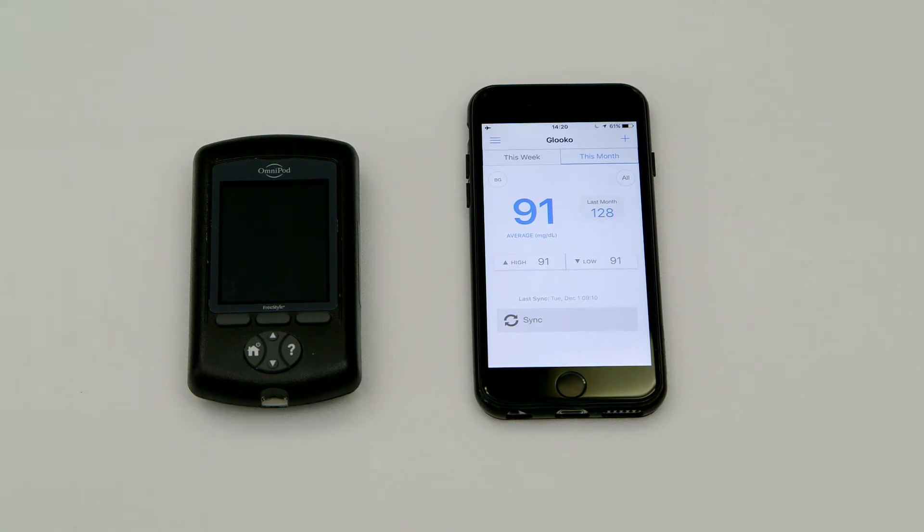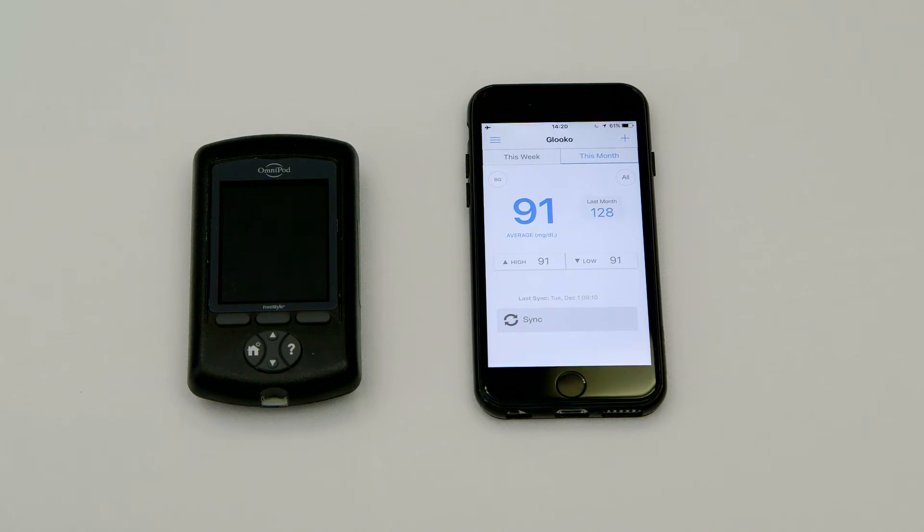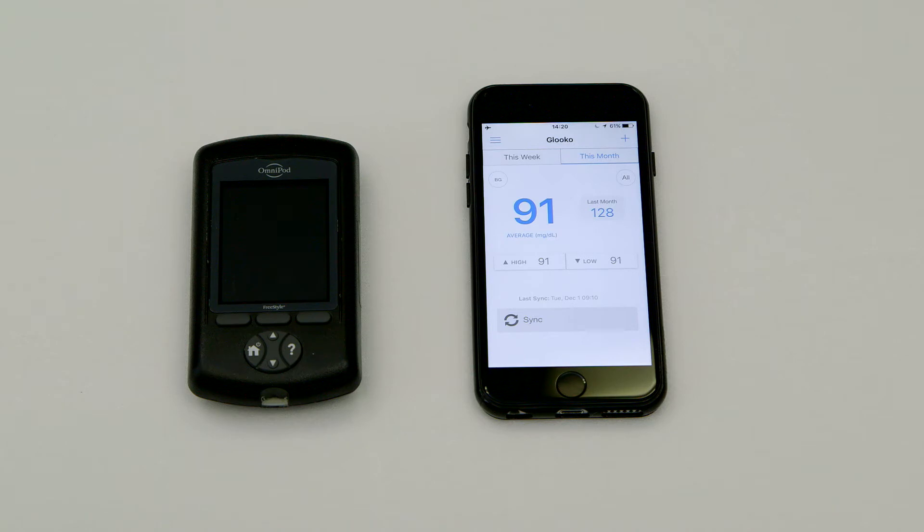After you have successfully synced an Omnipod to your Android device or the web, simply log in to the Gluco mobile app on your iOS device to view your data on the go.